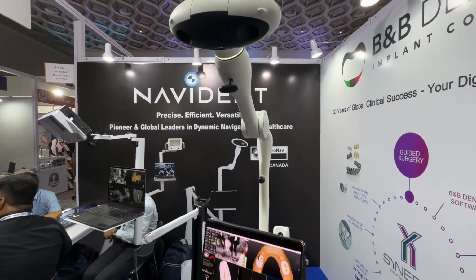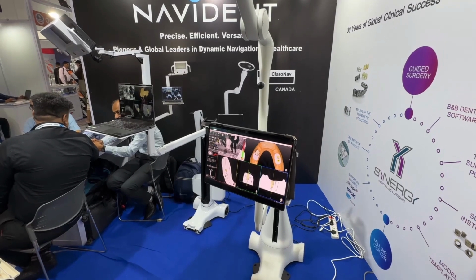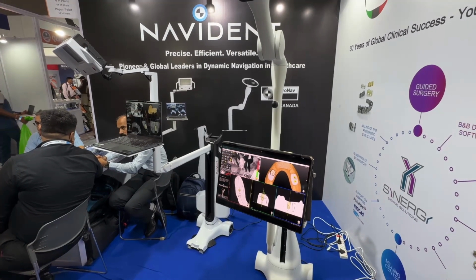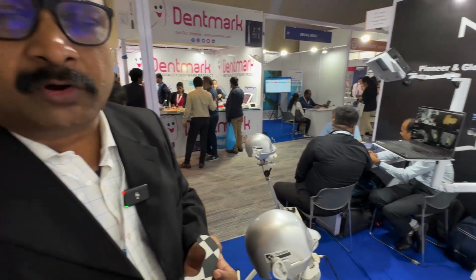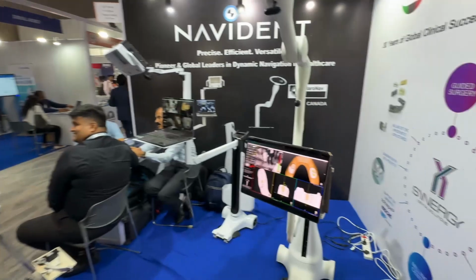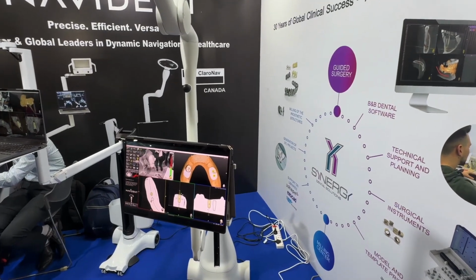The concept we are talking about is image guided navigation. You need a base source data, and what you require in order to use this device is CBCT data only. This technology relates to dentistry and image guided navigation for multiple indications: guided endodontics, implantology, full mouth rehab, immediate extraction and implant placement, sinus lift procedures, zygomatic implant, pterygoid implant, and more.